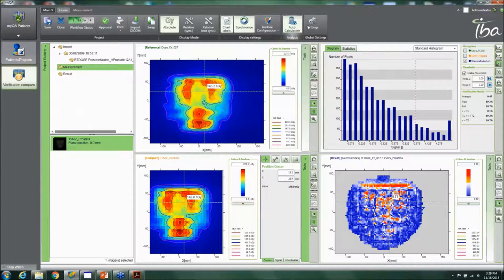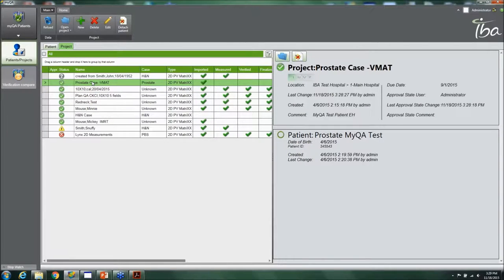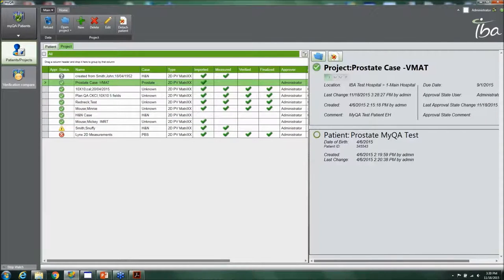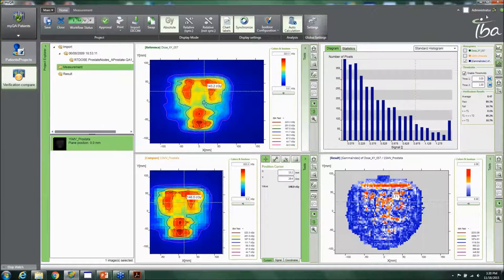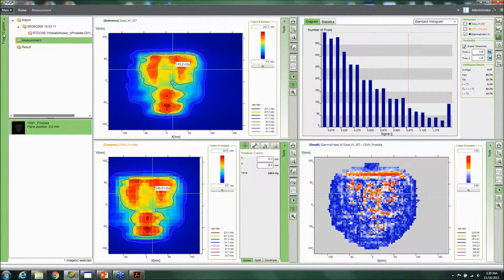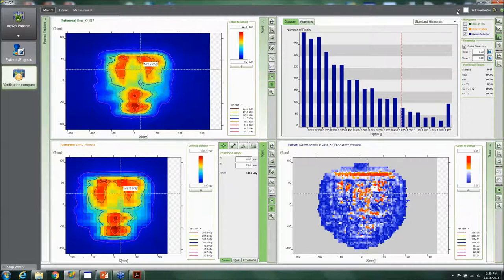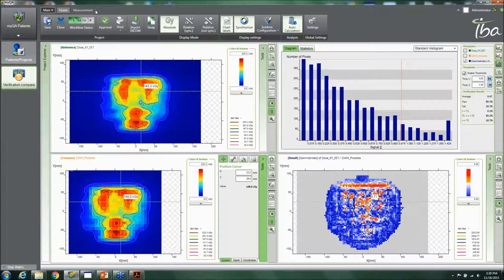The auto-calculation feature automatically performs the calculation whenever you make a change, so you don't have to manually trigger it each time. The patient list gives an easy overview of what patients still need to be done and which can be addressed later. You can also customize the screen layout — for example, expanding certain windows for a bigger view during verification. A stopwatch feature lets you track how long each QA task takes.